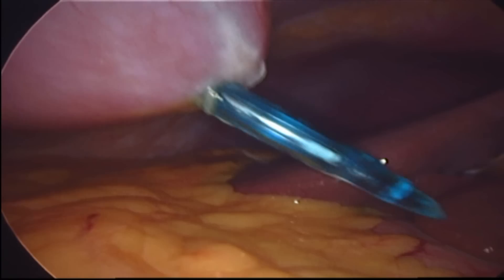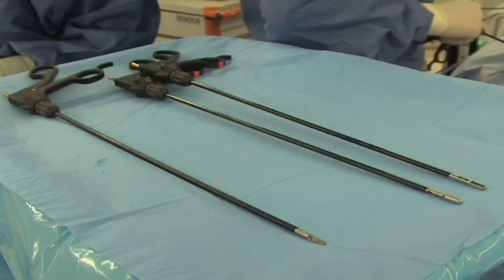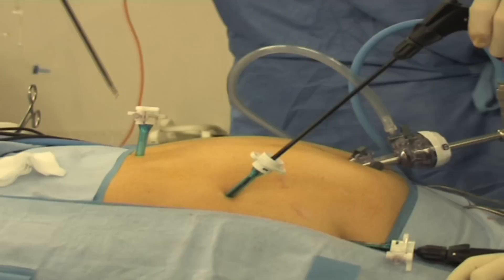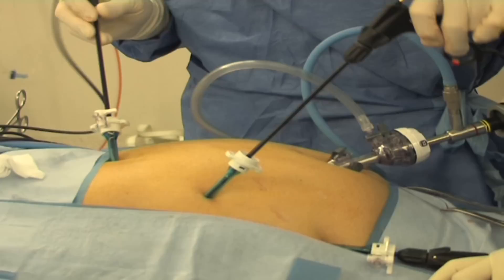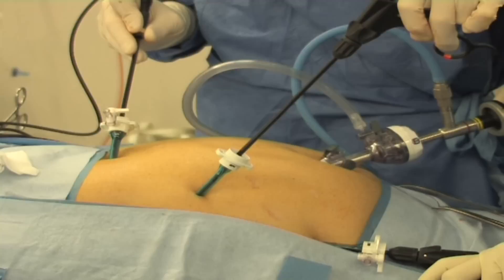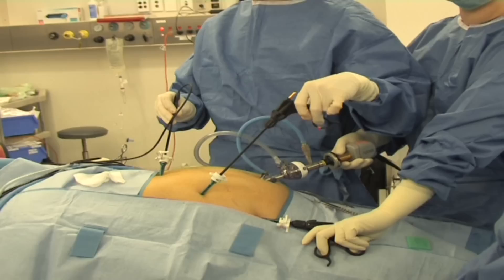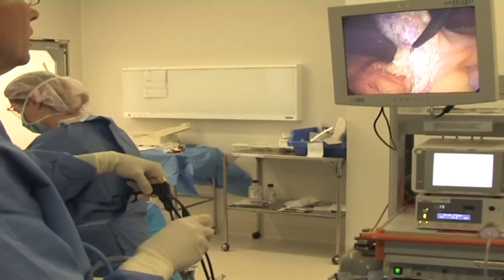These allow the long instruments that you can see here to be inserted, and these instruments are used to dissect the gallbladder. An excellent view is relayed to the monitor shown here.